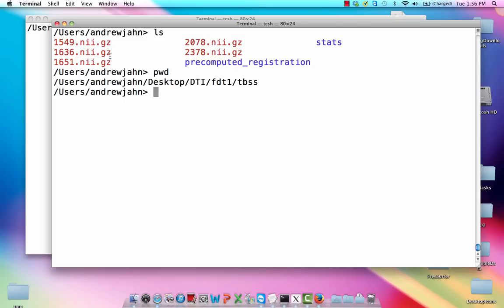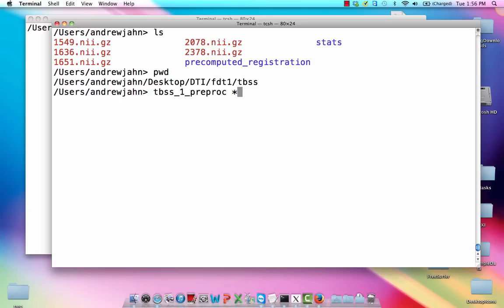We're going to use these different TBSS tools, which fortunately in FSL are labeled in order to do all the preprocessing before we analyze it with a general linear model. So the first command, I said all these are prefixed by TBSS, is TBSS_1_preproc. And all you need to do is give it all of the different FA files you have in your directory. You can either specify them individually or just grab them all with a wildcard like I've done right here.